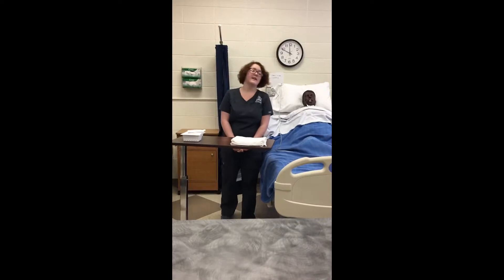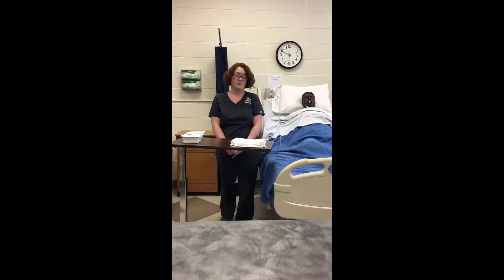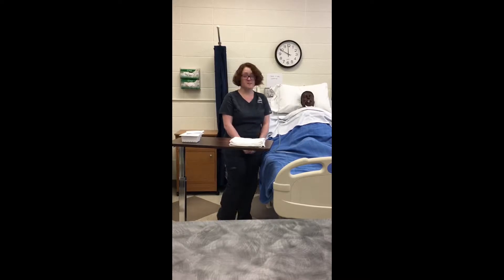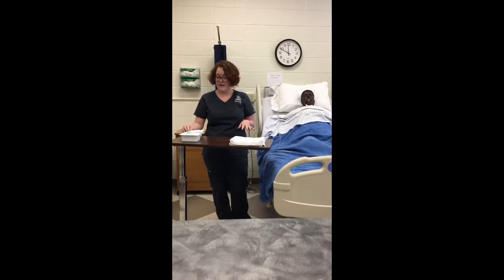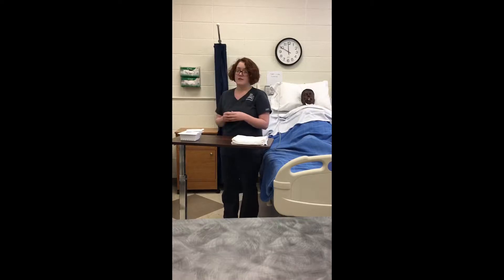My name is Taylor Erfling. Today I'm going to be performing nasopharyngeal suctioning. It is April 6th and about 11:50 in the morning. First, I'm going to go in and assess my client for the need for suctioning. After I've determined that they need suctioning, I'm going to assemble my equipment. I have a sterile suction catheter tray, a towel, and I have clean gloves in the room.